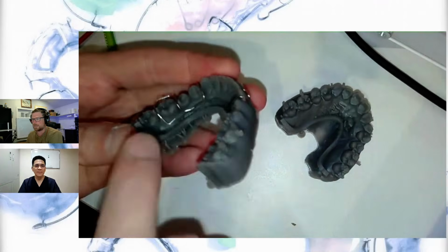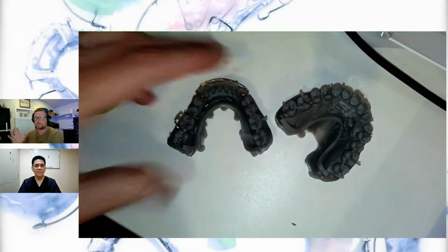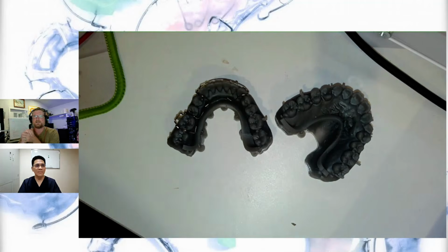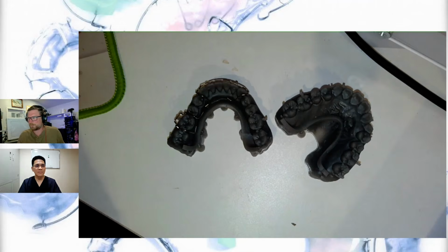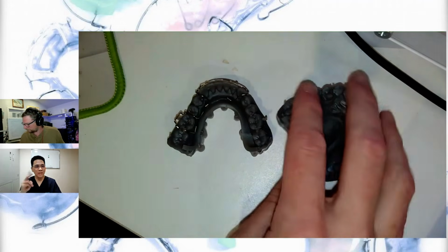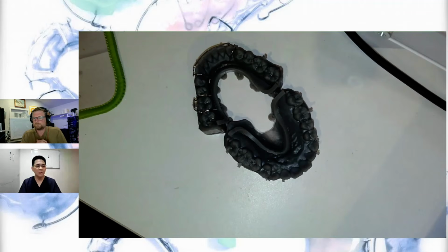It's using something along the idea of the fence, creating a fence for the block. Is that correct? Yes, just a simple way of thinking about that. Maybe two weeks later we can make a video to talk about the digital twin block. So everybody stay tuned.